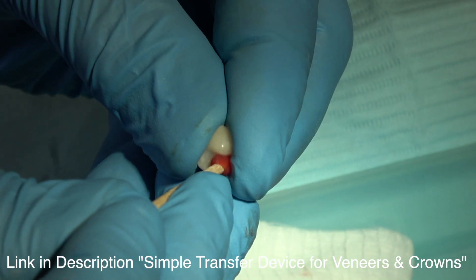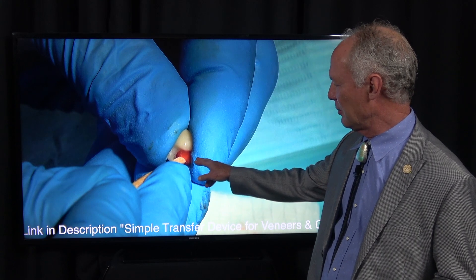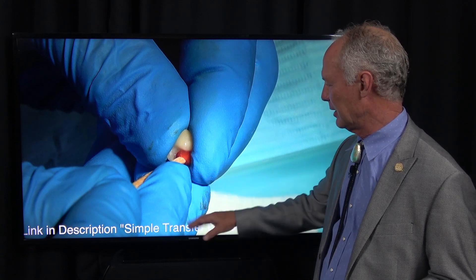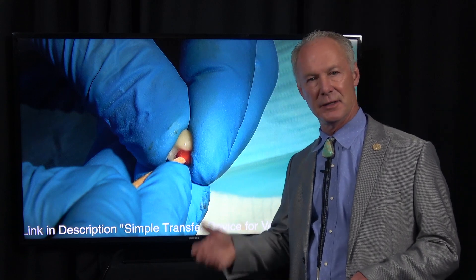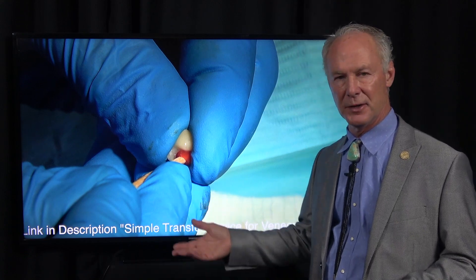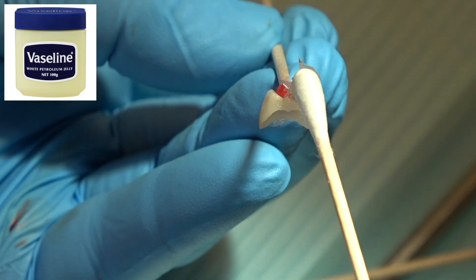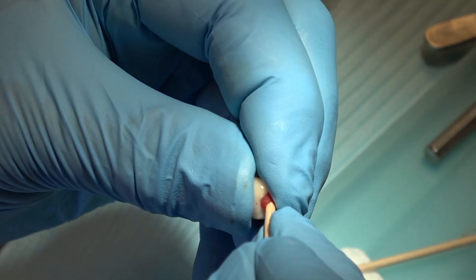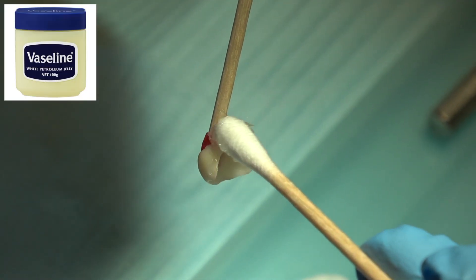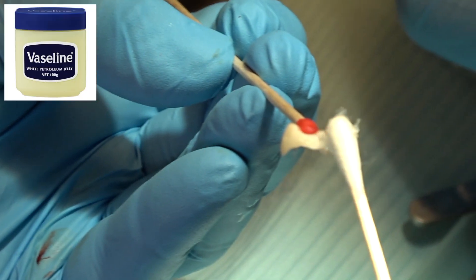Dry them really well. Then this is a wonderful carrier — just red rope wax on the end of a cotton tip applicator. You can refer to that link. I use that to carry crowns, inlays, veneers, bridges, so you don't have to put your fingers in the mouth. Then always put a little Vaseline on the interproximal contacts of crowns, veneers, and inlays — that prevents the cement from setting up in the contact area. Get everything ready.